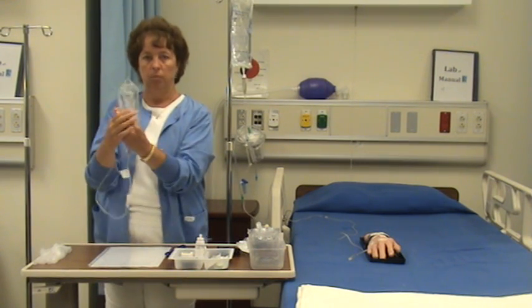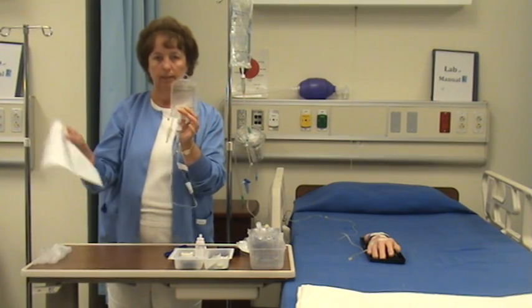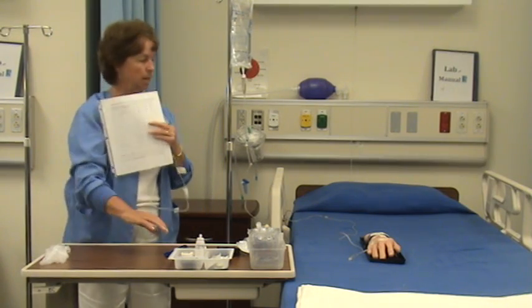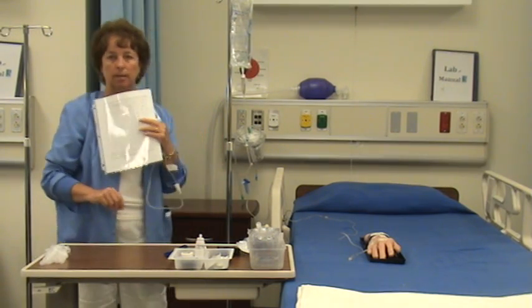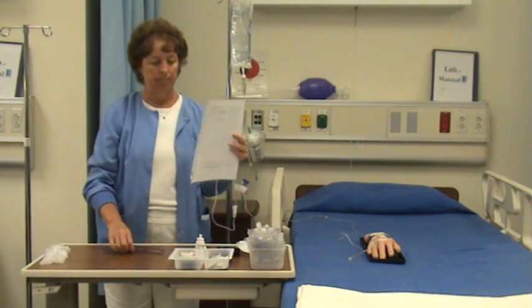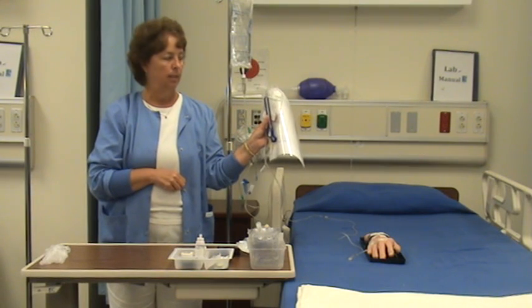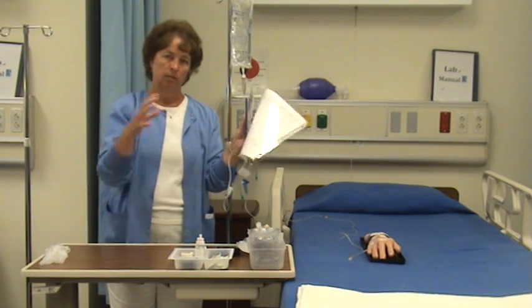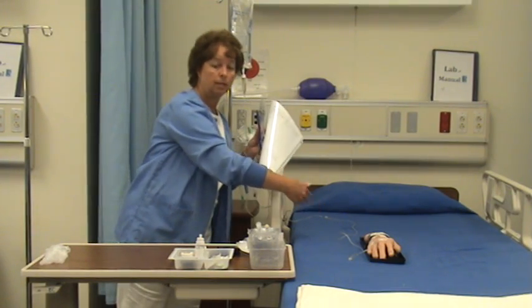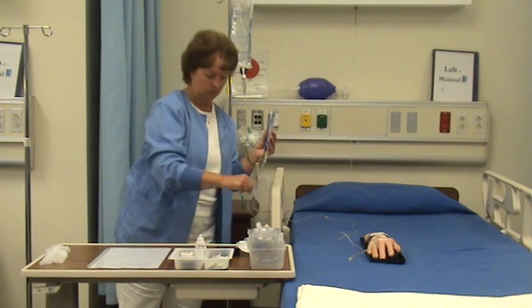Okay, now I've washed my hands, I've got the medication, I've got the MAR. I don't particularly need gloves for this because I'm not going to actually be down at the site where I could be exposed to body fluids. I also have a hook that I'm going to use to start my secondary medication. So I'm going to take all this into the room. I come in the room, use 2 identifiers for the patient, do my 3rd check with the medication.